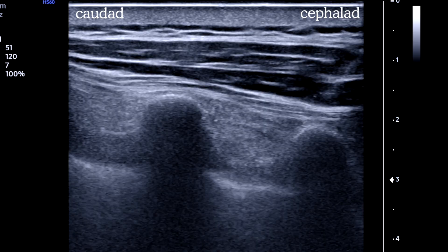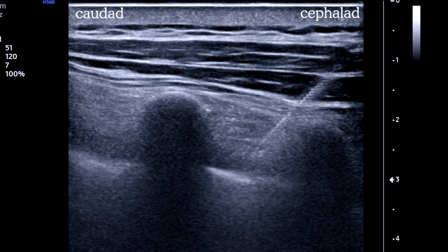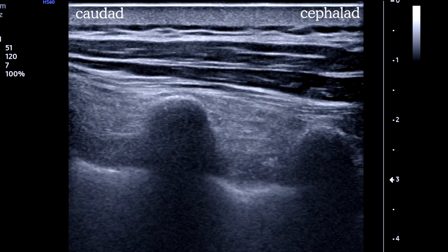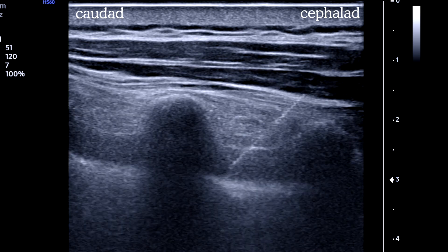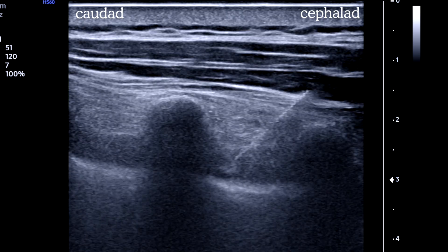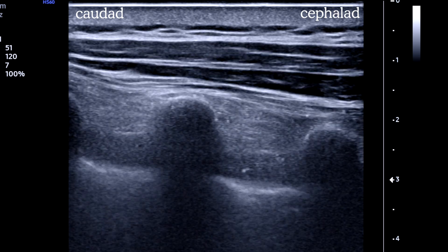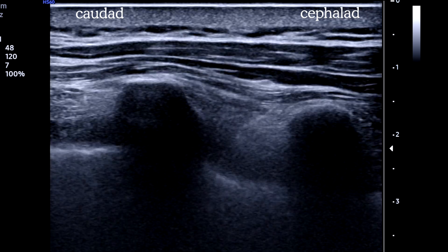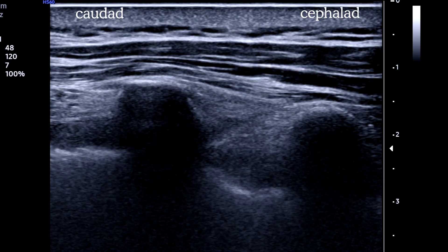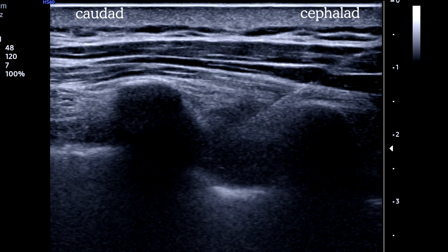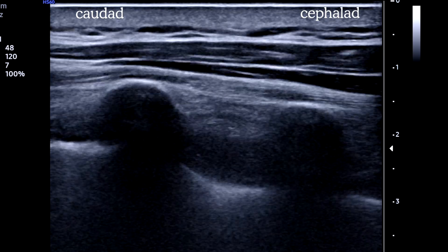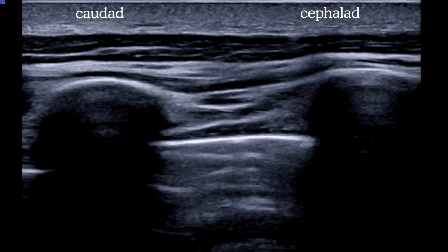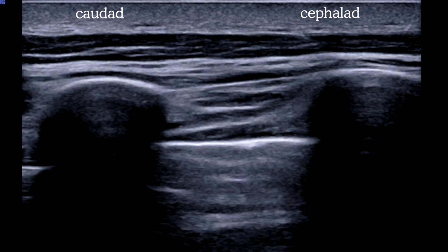The needle approaches the intercostal space from cephalad, although you can come from either side. As we enter the intercostal muscle, we begin to use small squirts of saline to hydrolocate, advancing a millimeter at a time until we see the saline expanding over the pleura, then administer the local. If you see the extra-pleural space expanding, you're in the right spot and your block will be solid. At the next level, hydrolocate, then give the local when we see the target space expand. Sometimes you'll see the internal intercostal membrane elevating along with the pleura depressing. I prefer the out-of-plane approach, which uses the same principles — hydrolocate, advance, hydrolocate, advance — until you see that expansion above the pleura. It's a very safe method, and though you won't see your needle, the hydrolocation keeps you safe.